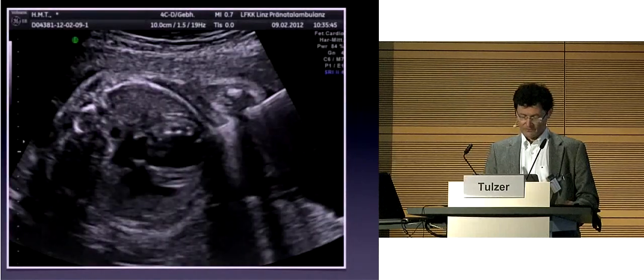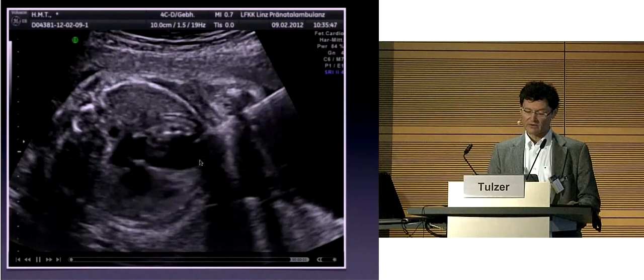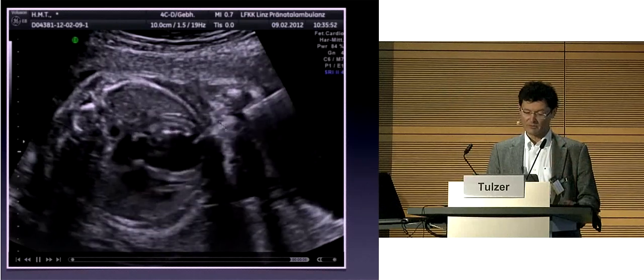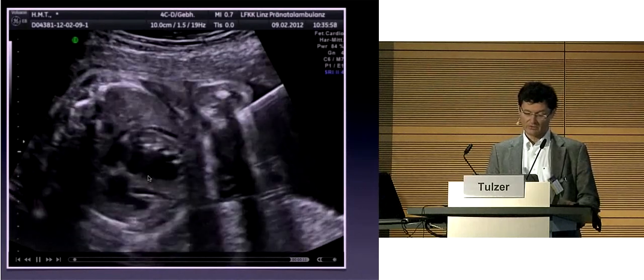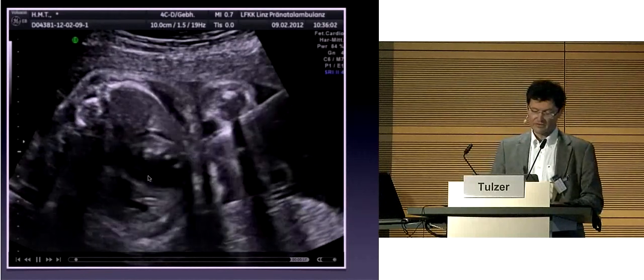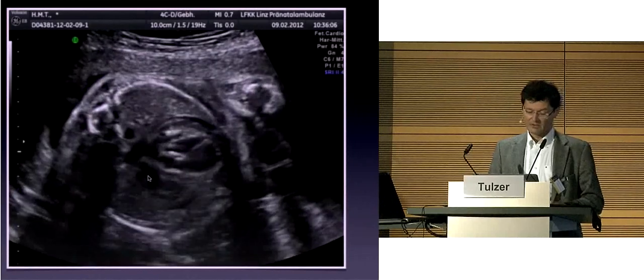So just to show you, this was the ventricle at the time of intervention, and you can see this ventricle isn't doing anything anymore. It's just a little bit of contraction at the septum, but nothing more. So here's the needle again. I'm going into the left ventricle, crossing the aortic valve and dilating it, as you can see. Now we're in the left ventricle.